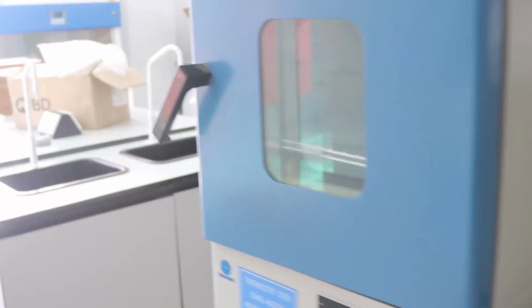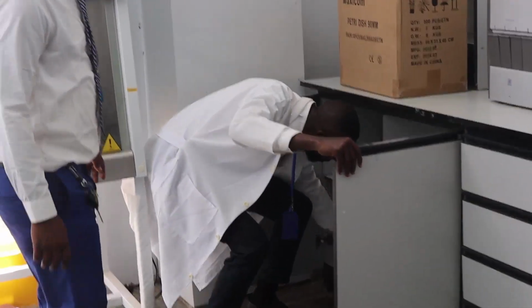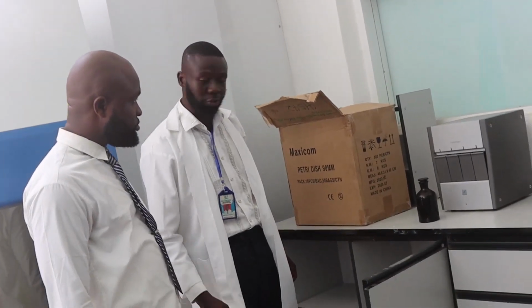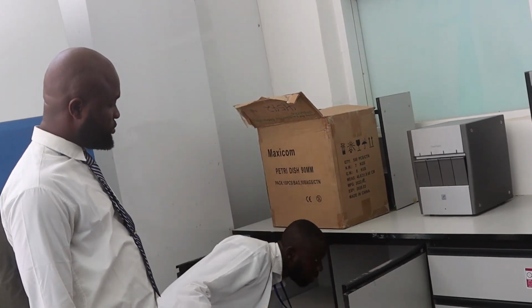Over here, we have most of our stains. We work with these stains. As you can see here, this is what is known as Giemsa stain. With this stain, we stain and do diagnosis. Most of the results we issue, these are the equipment we use in doing them.